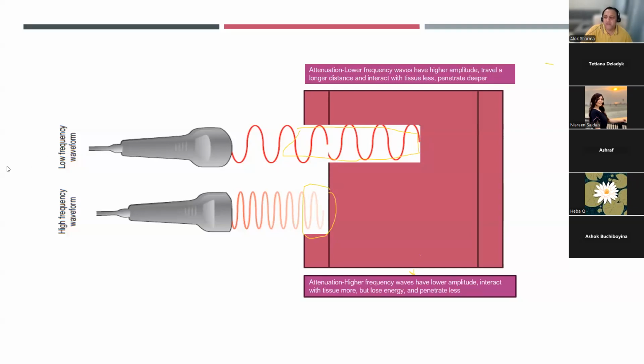So how is this relevant? It's relevant because if this is pleura and I want to see pleura, the superficial layers are quite high in density as compared to the depth of the lung, which in a term baby, on average, we want to keep at about 4 centimeters.